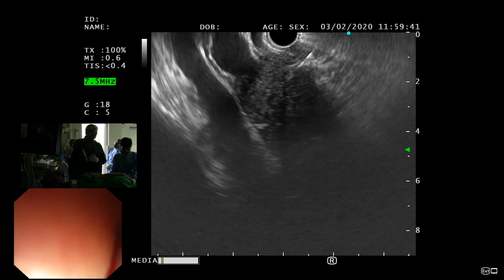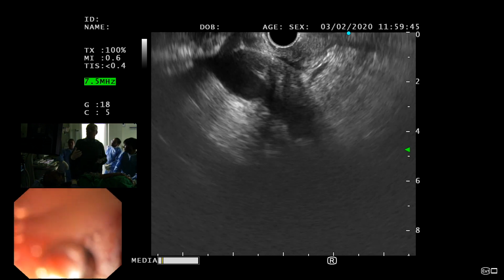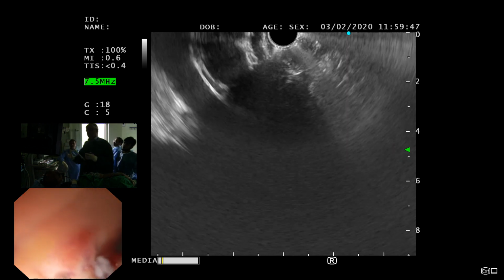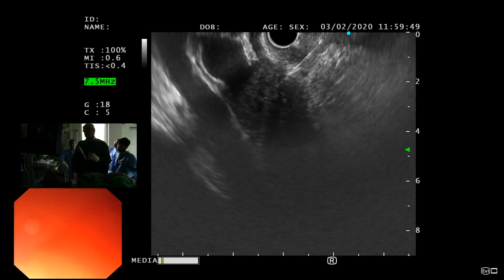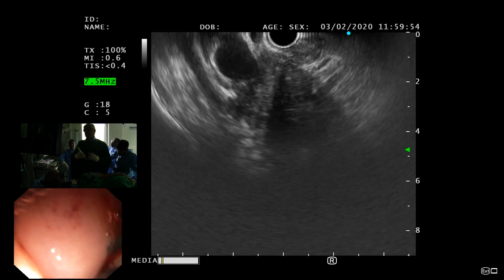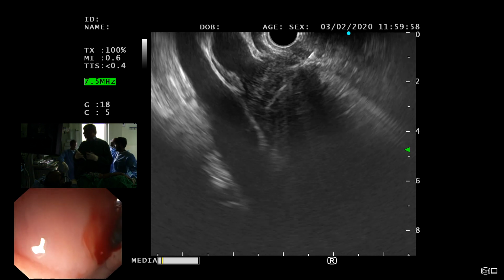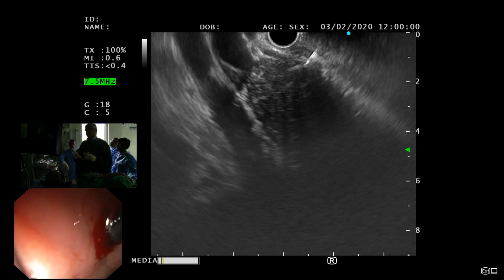It's the shoulder movement, Kashif. So the needle is gone, and I'm only going to move my shoulder here, and the needle is back here. Okay, and it's in view. So if you lose the needle, you just need to go back. You just move your shoulder, and you should be able to see the needle.